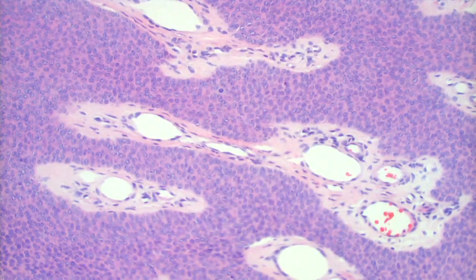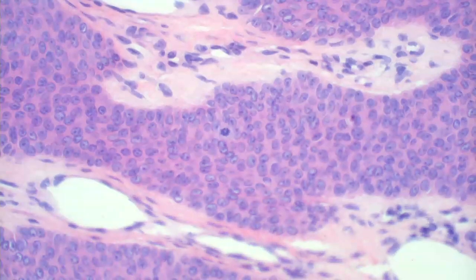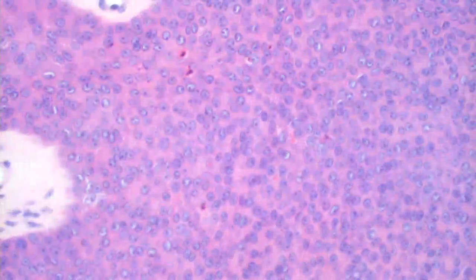So you don't just say, oh my God, this is porocarcinoma. It's got one mitotic figure. No, that doesn't change the diagnosis. Everything else is benign. You just remember you can get some of this necrosis in these lesions and occasionally a mitotic figure or two.